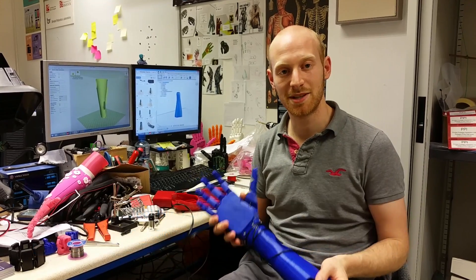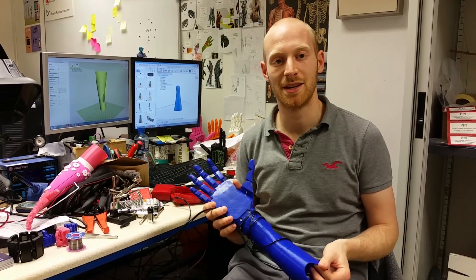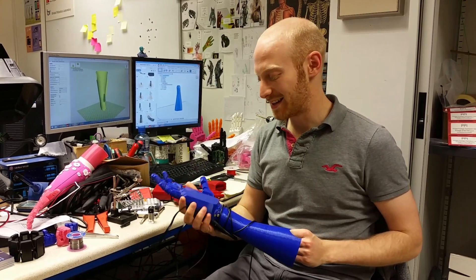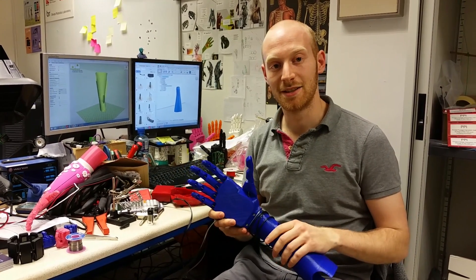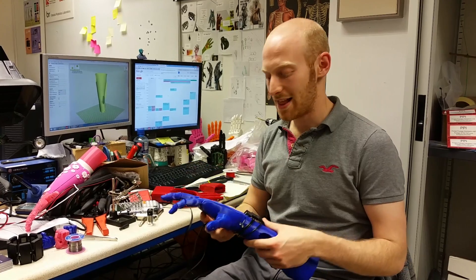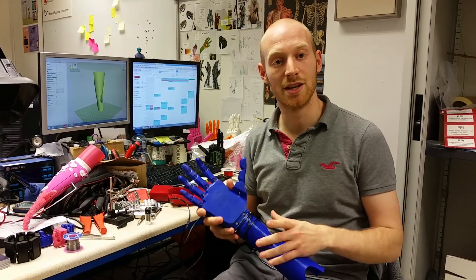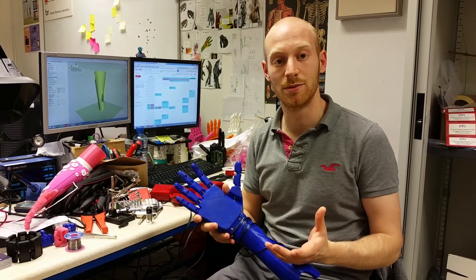My name is Joel Vibard and my company is called Open Bionics — Twitter handle at Open Bionics, website www.openbionics.com. This is our latest robotic prosthetic hand, and the idea of our work is to make advanced robotic prosthetics more affordable and accessible.